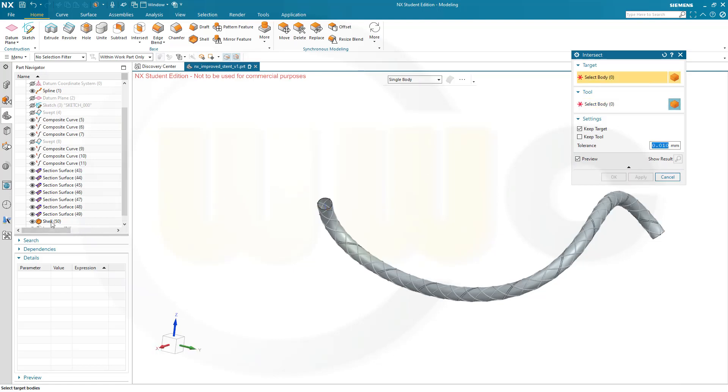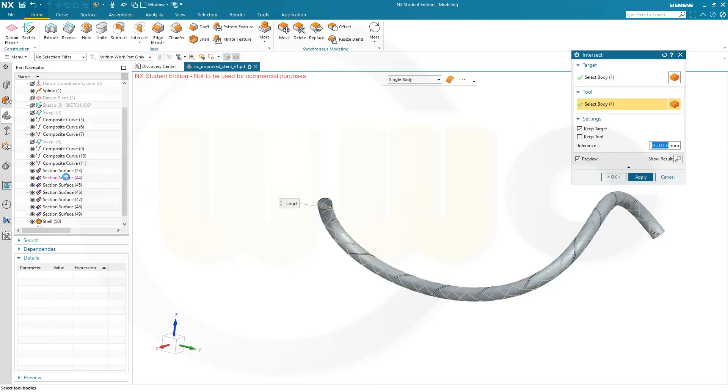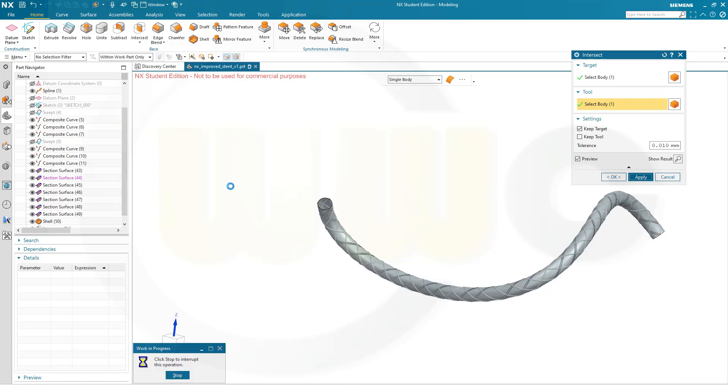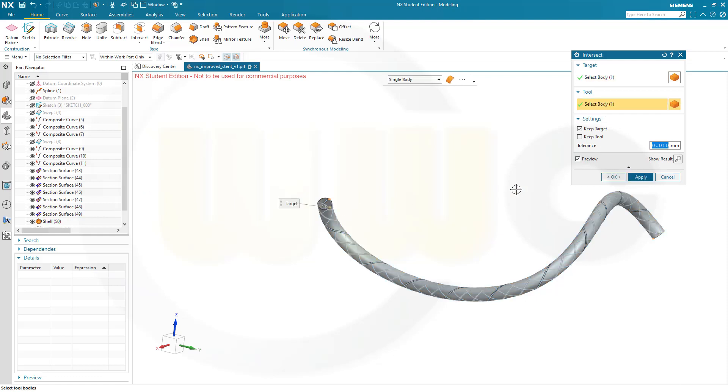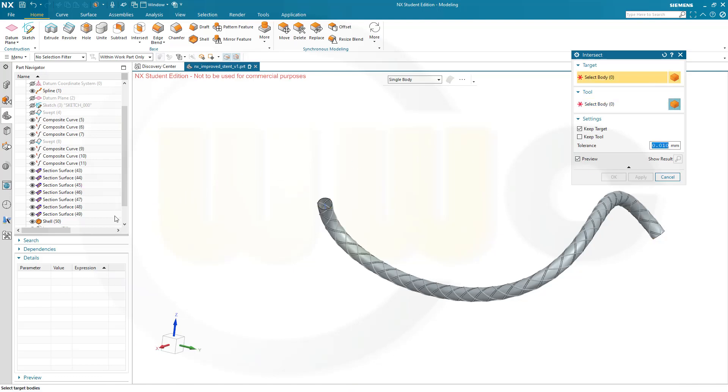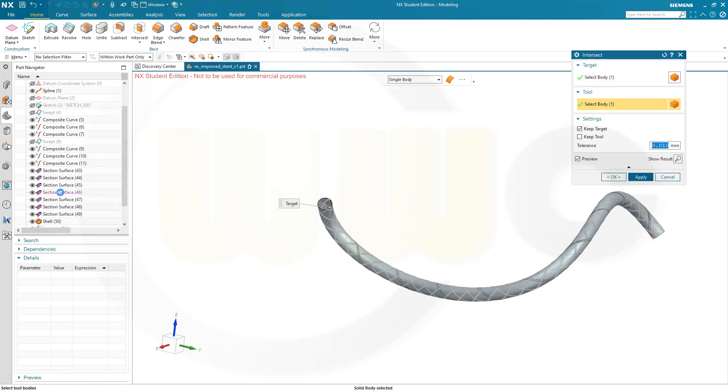Then use that shell again, go to the second one, apply. Then use the shell once more, go to the third one, apply. Use the shell once more, select the fourth one, apply.